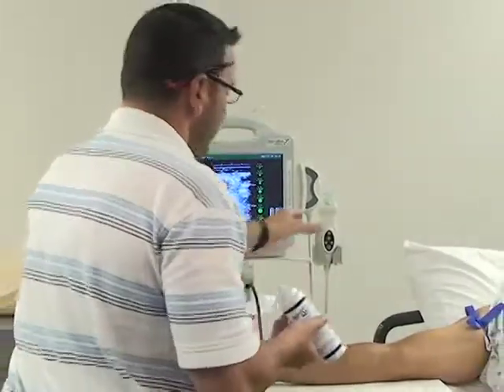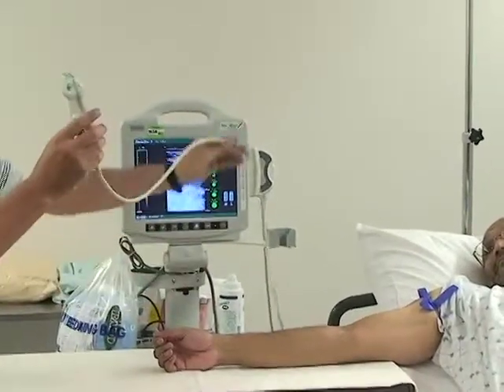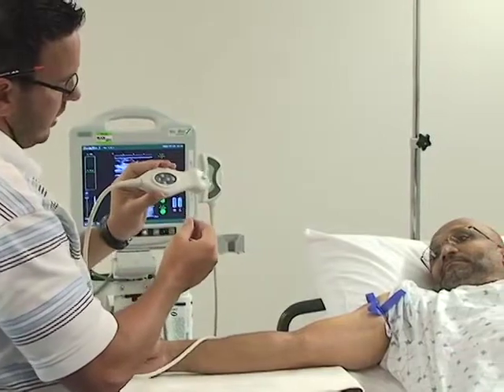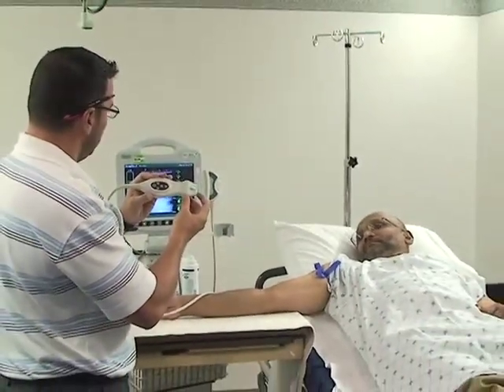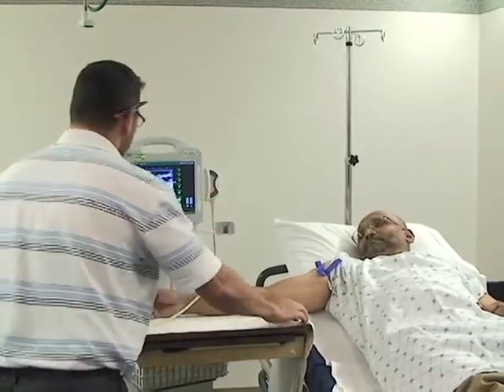But just to review the anatomy, we'll look real quick. So if you want to step up here, Carl, and or Kim, and start looking, I'll show you. You're going to hold the probe like this. If you hold it this way, facing you, then you can identify that this is the left side and this is the right side. And why does that seem backwards, Carl?